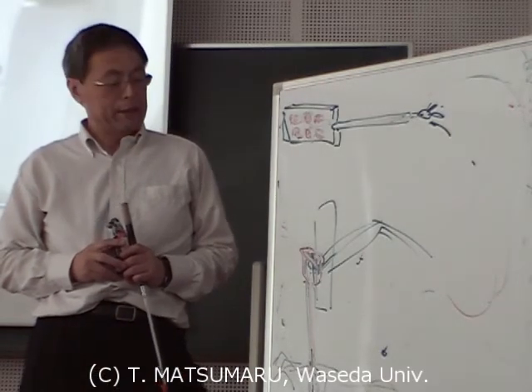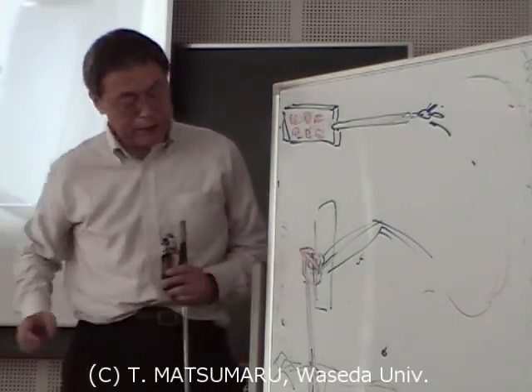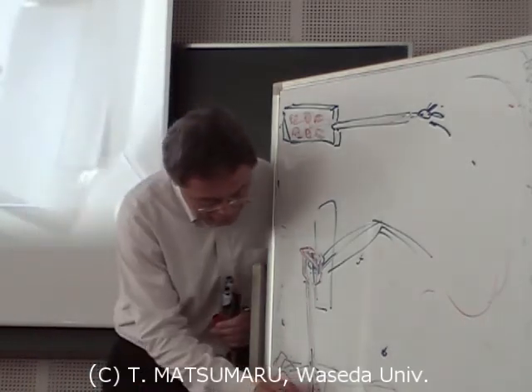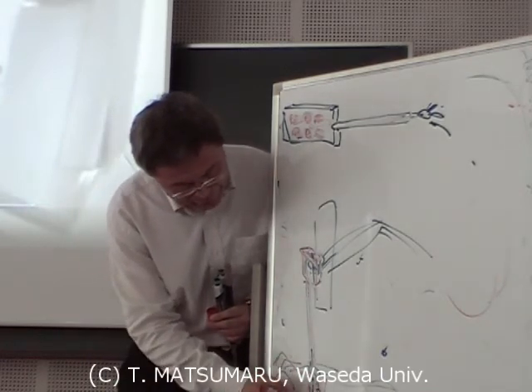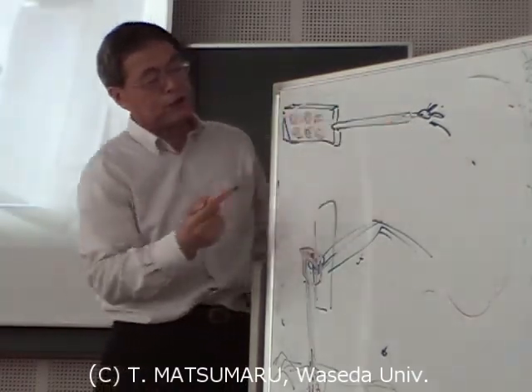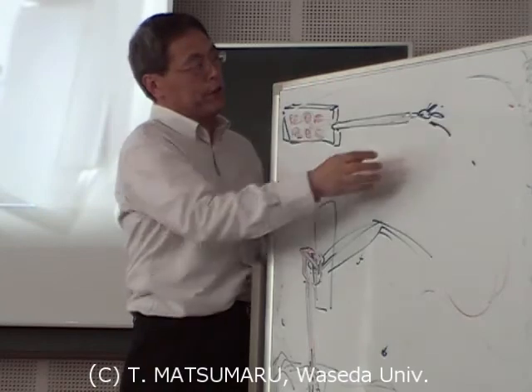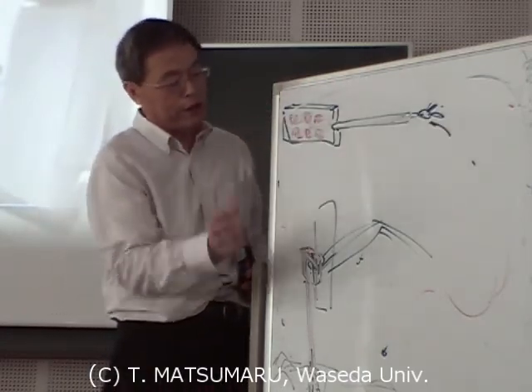But why is this part attachable and releasable? Because the patient may be suffering from a virus or other dangerous conditions, this part should prevent infection. So the virus-killing operation, sterilization, is necessary once it is used on one patient.